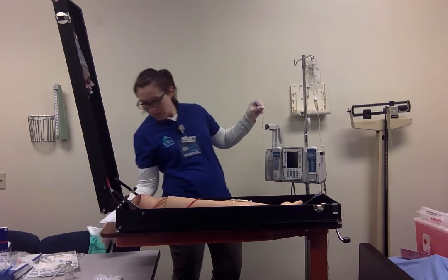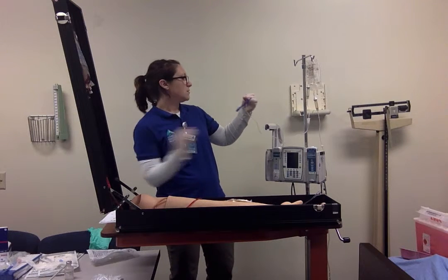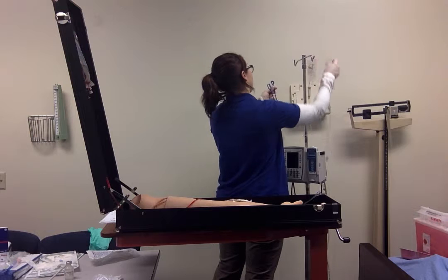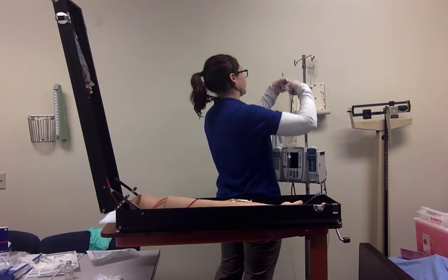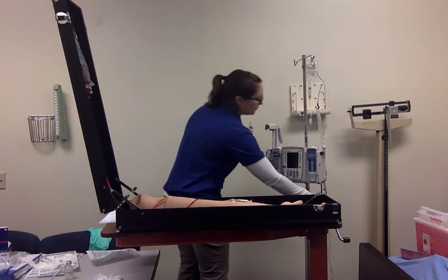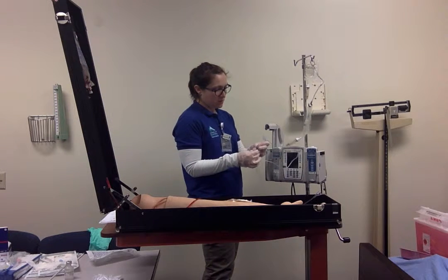And I need to lower the primary bag first, and go ahead and attach it to this port.